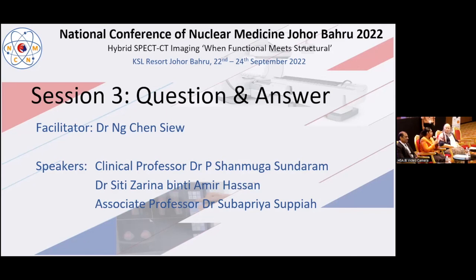So I wouldn't say that it affects the tumor to background ratio, because you will then become familiarized with a new background. The new background will be the new baseline setter. And so anything beyond that would then be pathological. So you base it on what is your denominator. So previously, if you're using non-contrast-enhanced scans, maybe the SUV of the liver will be around 2.5 to 3 SUV max.